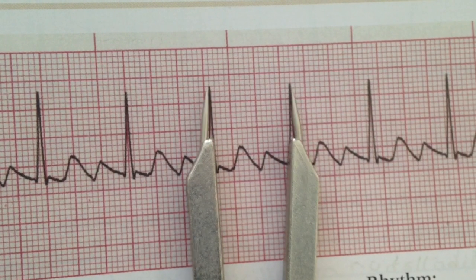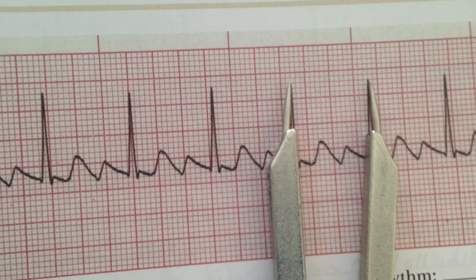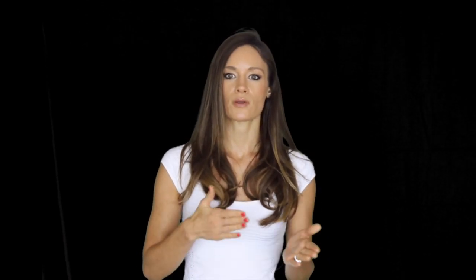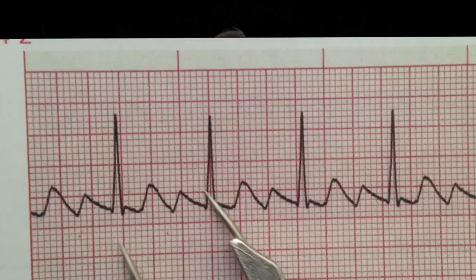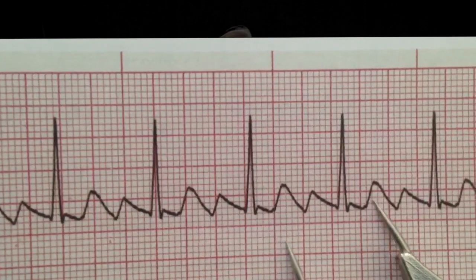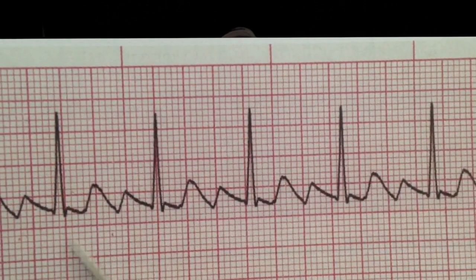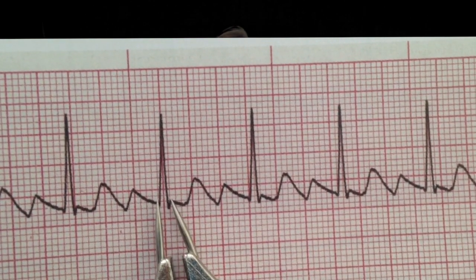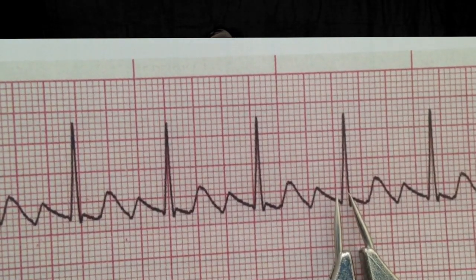Now let's look at another atrial arrhythmia known as atrial flutter. Using the systematic approach: first, the rhythm is pretty regular. Counting the 6-second strip we get 90, which is still considered regular. Next, looking for a P wave — there is clearly no P wave, but we see several sharp deflections. This is what we commonly see with atrial flutter; I think of it like bird wings going up and down due to the sharp deflections. Since there is no P wave, PR interval cannot be measured. The QRS complex is within normal range, making this an atrial arrhythmia of atrial flutter.